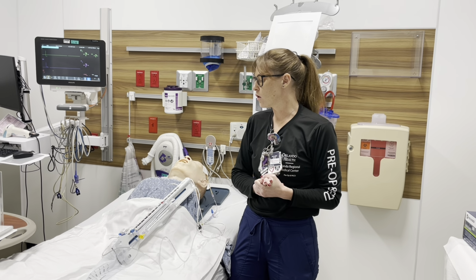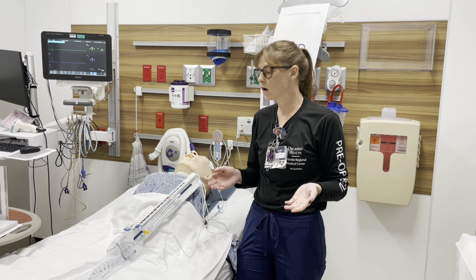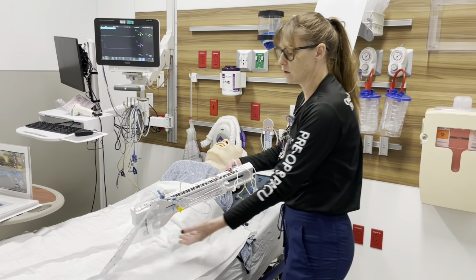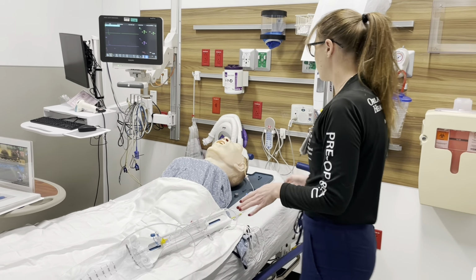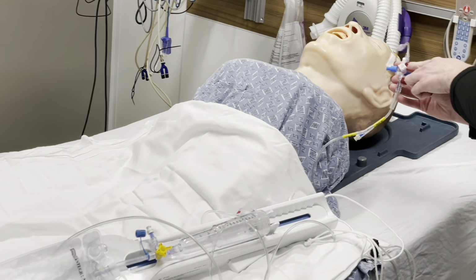Okay, so going forward, we will talk about what to expect when your patient comes out of the OR. Typically, they are going to be laying down. They may be intubated. They may not be intubated. Typically, they are still at least pretty sleepy. So the first thing that we're going to do is go over to our patient and check all of our stopcocks, because again, at this point, we don't know what type of drain it is. So we're going to make sure that this is off to our patient.